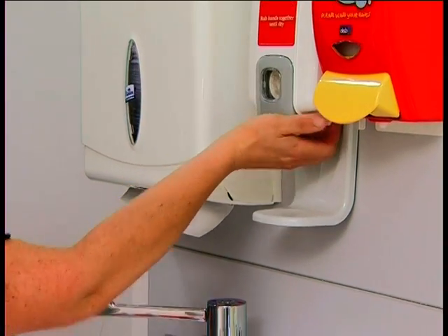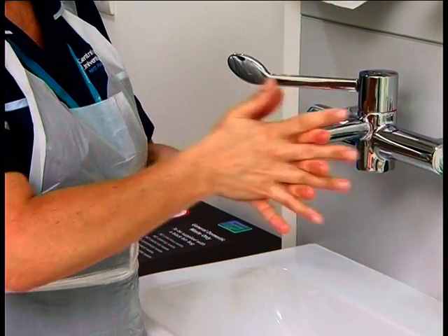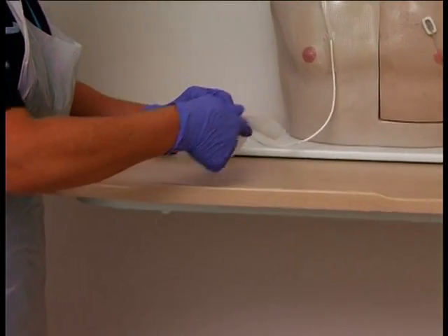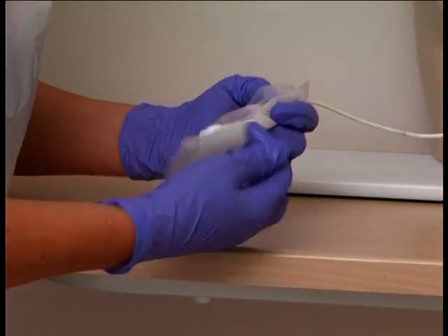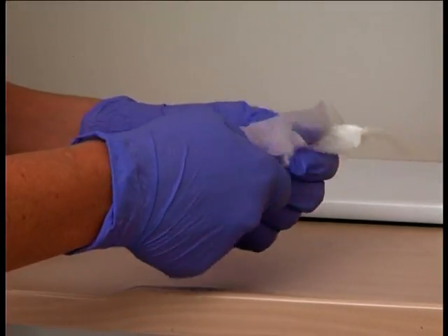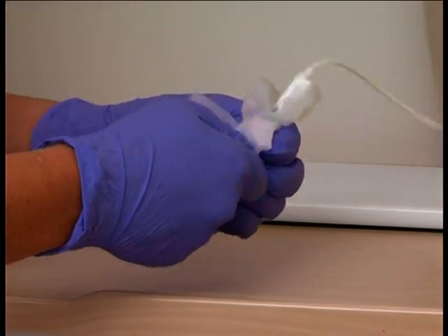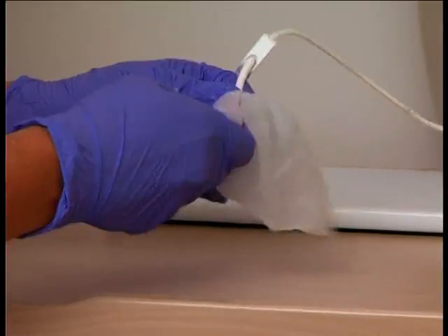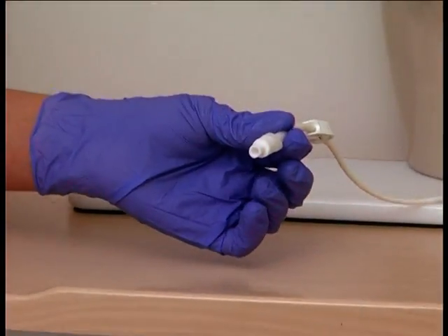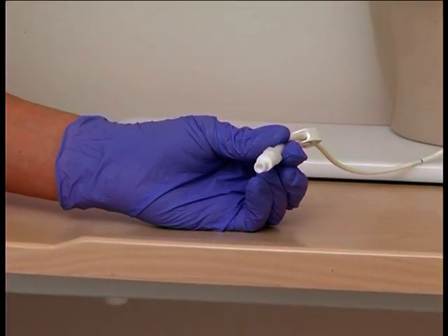Clean your hands with alcohol gel using the same 7-stage technique that you used for washing. Put on a pair of non-sterile gloves. Using a CHG wipe, clean the CVC and catheter cap by rubbing for 10 to 15 seconds and making sure that there is good application of the solution to the connection. Hold the CVC, taking care not to touch the connection. Throw the wipe into the rubbish bag and allow the connection to dry for 30 seconds or longer if it still looks wet.